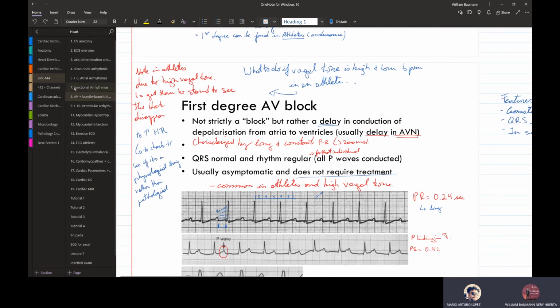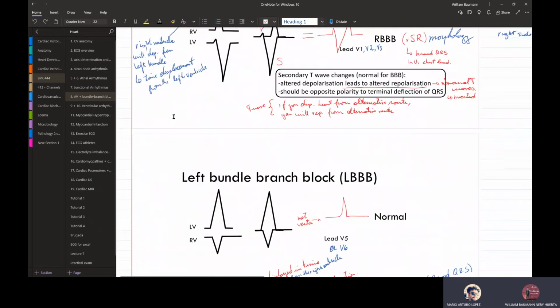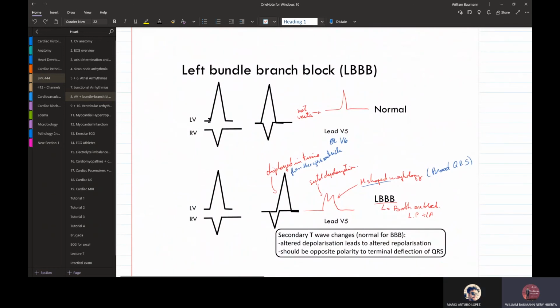And as we go through those sides, you're expecting the left ventricle to receive a high positive deflection because it's coming towards it. Yeah, 5 is coming towards it. The right ventricle should be going away. The combination of both, you get a vector that's a bit smaller than the LV one. It's just saying that the left ventricle with the right ventricle combined, you're going to get a smaller positive deflection, which is fine.